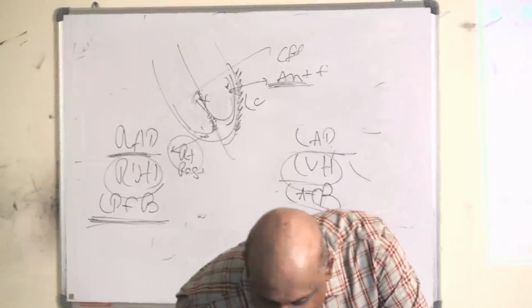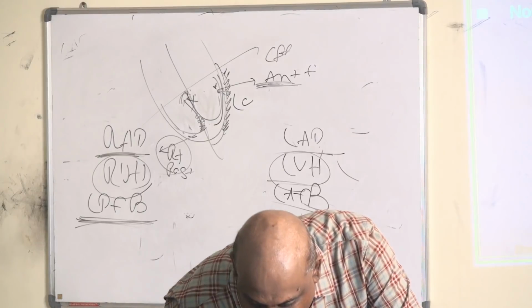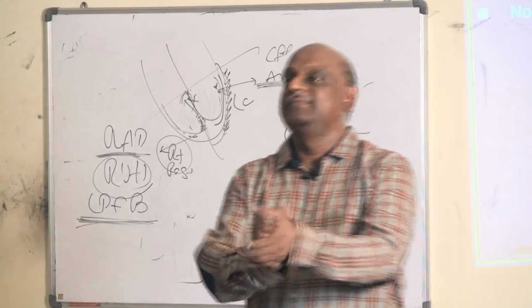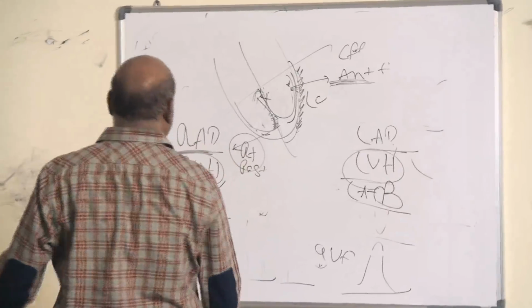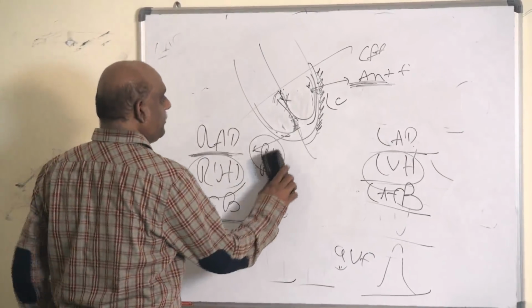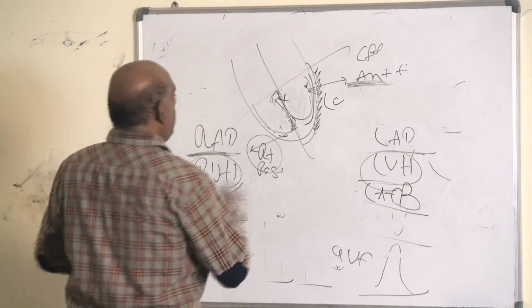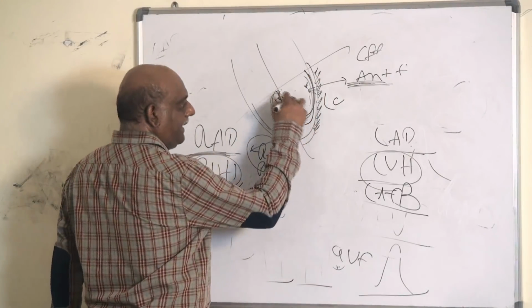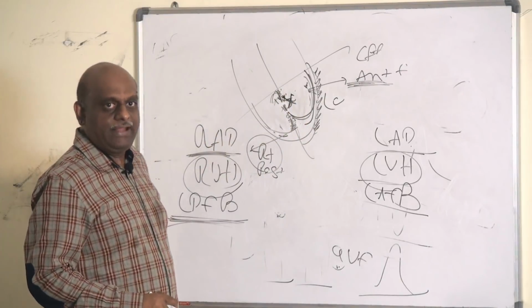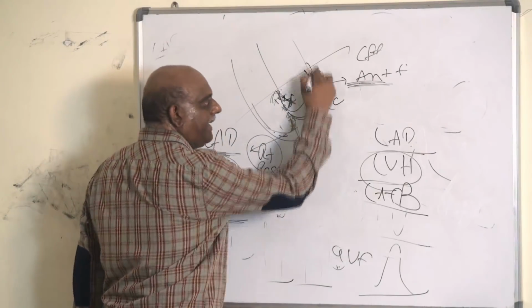Nivedita proposes right axis, Shivendra, Raghav, Madhushri, Jindabad. Left axis deviation. Why? Once more, think coolly, doctor. If the left bundle is blocked, right? Who has to do the donkey work of all this left bundle's area?